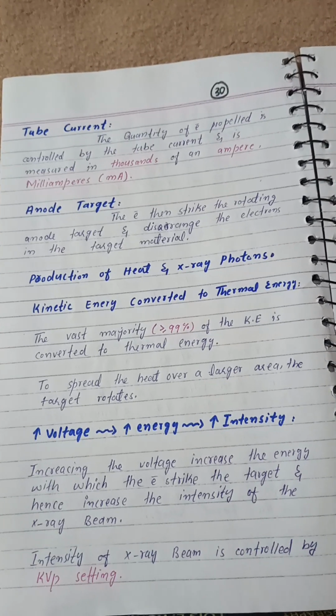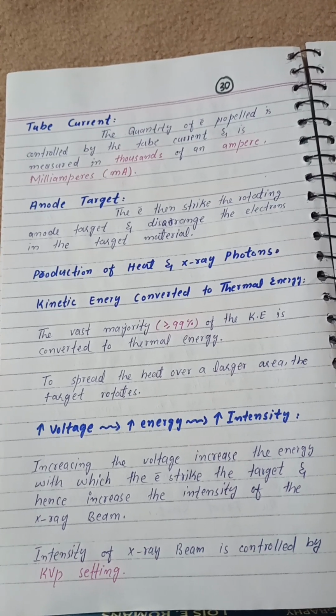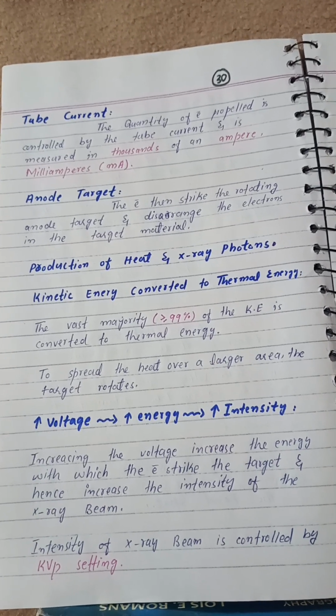Tube current. The quantity of electrons propelled is controlled by the tube current and is measured in thousandths of an ampere, milliamperes, mA. Anode target.